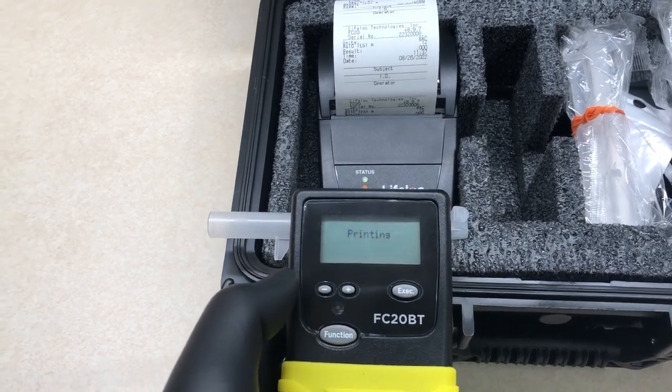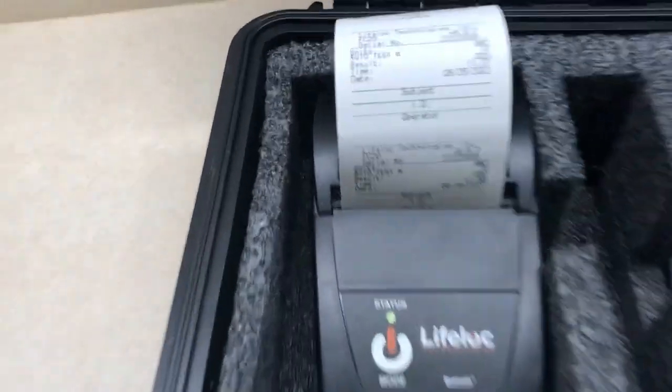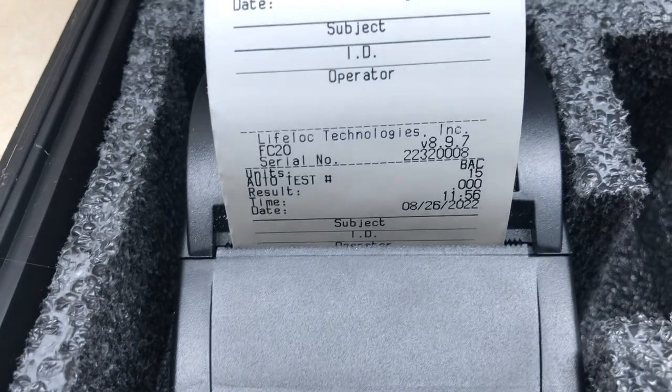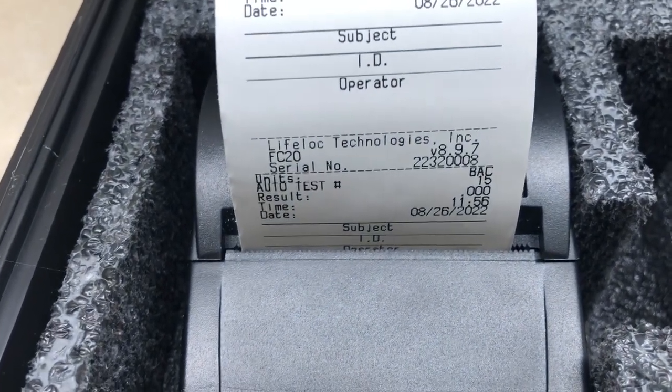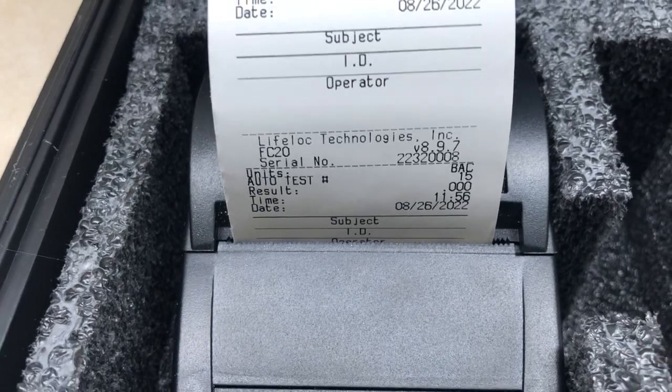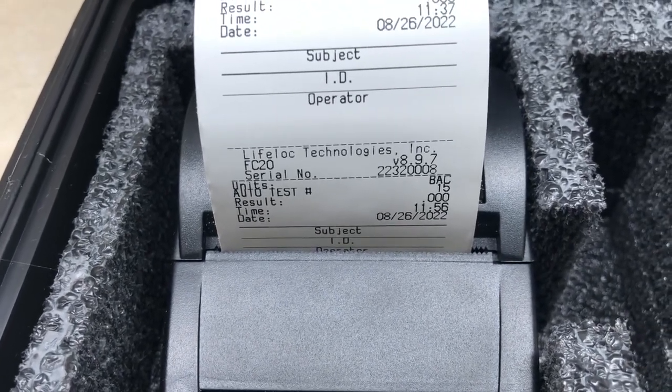I haven't tested that. But all you're going to be doing is printing, and then it gives you your results there. The units, it's a blood alcohol concentration. The auto test number, so this is the 15 tests we've run on it. The results are 0.000, and then the date and time.